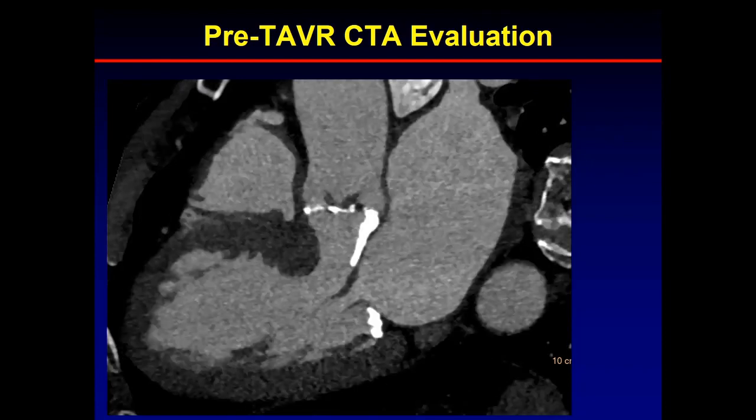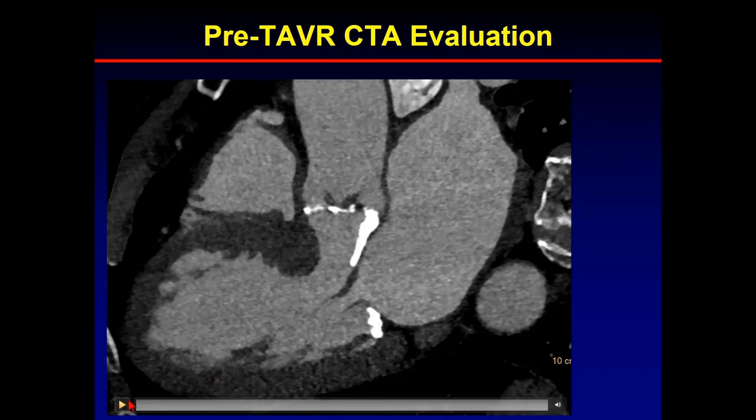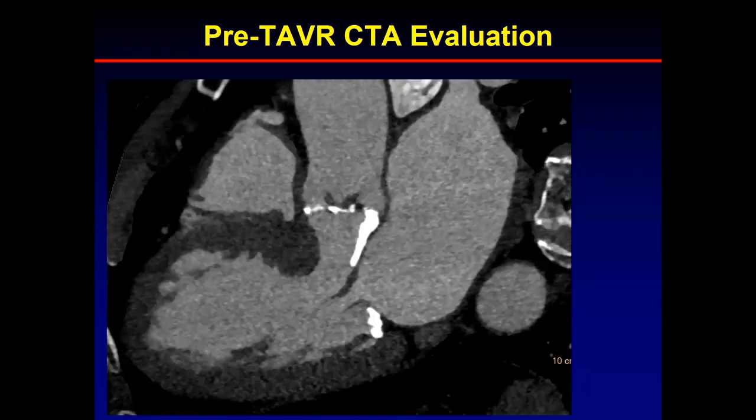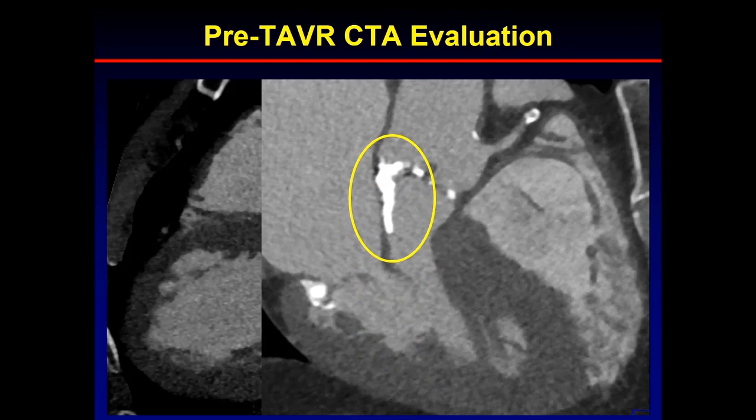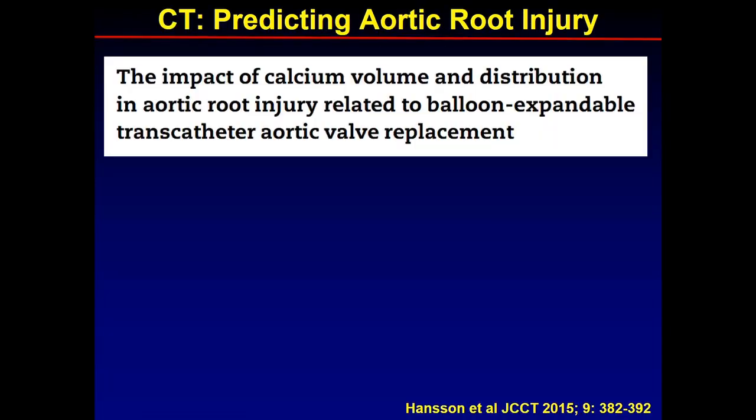There is significant MAC. And I hope you all recognize that there's also significant subvalvular calcification that extends really all the way down into the LVOT and even affects the anterior leaflet of the mitral valve, and very, very dense. So you can see that better here. In this particular view, all of this in terms of calcified valve and extensive subvalvular calcification. And this was along the non-coronary cusp and again involved the anterior leaflet of the mitral valve as well.